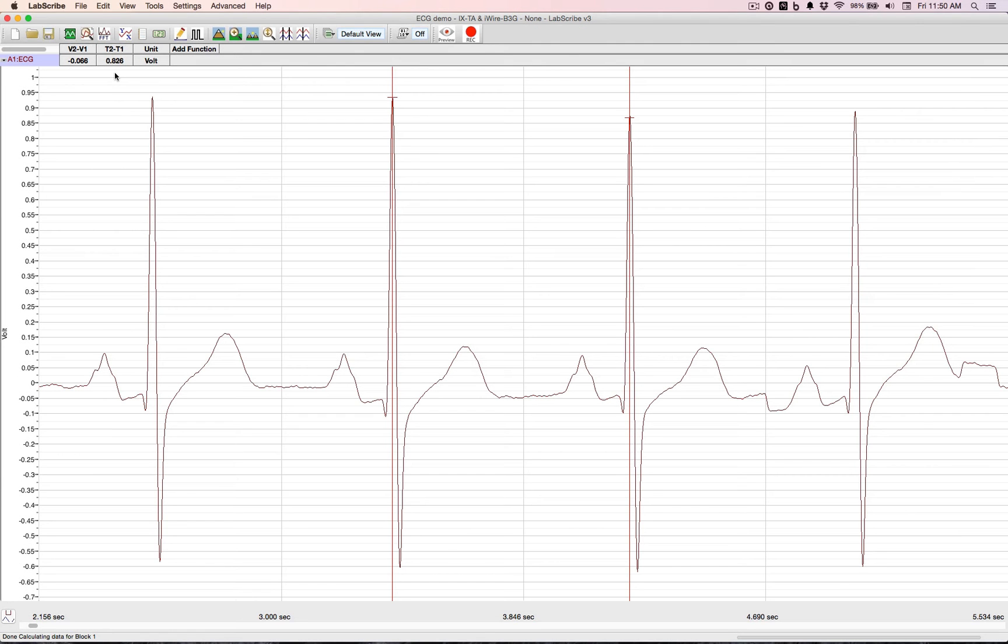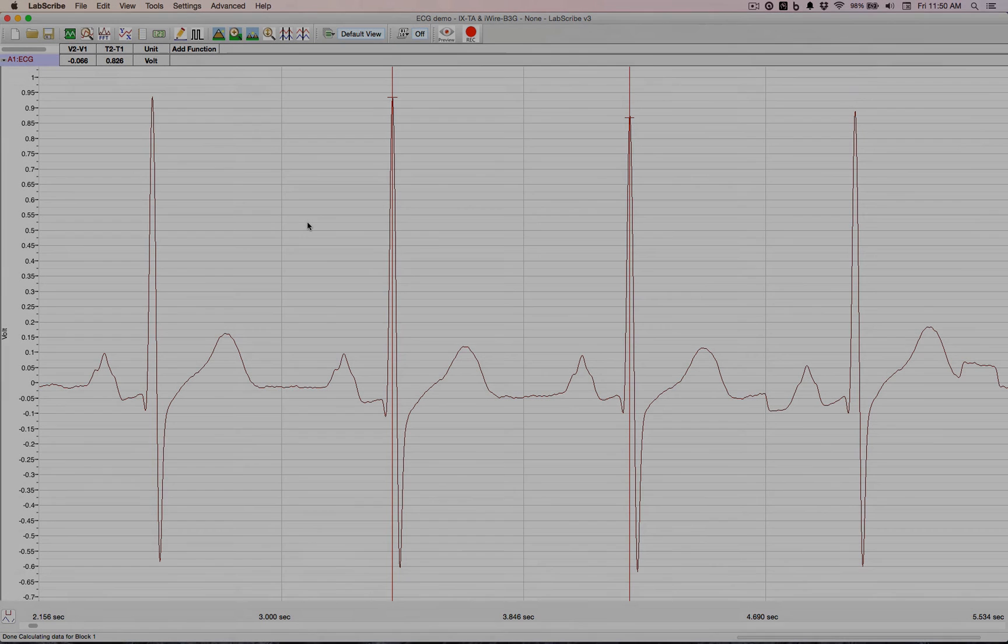So the student can fill out a table, add it to the report, and that's all there is to doing basic ECG measurements in LabScribe.